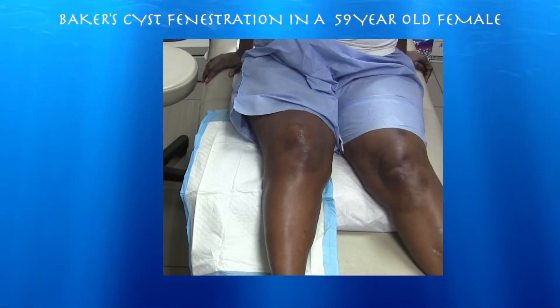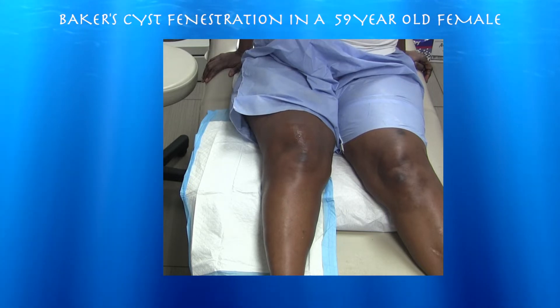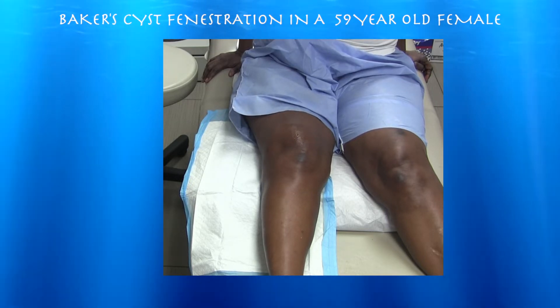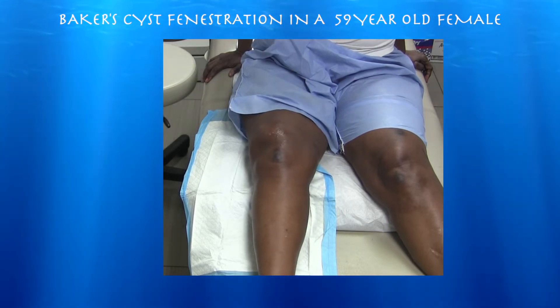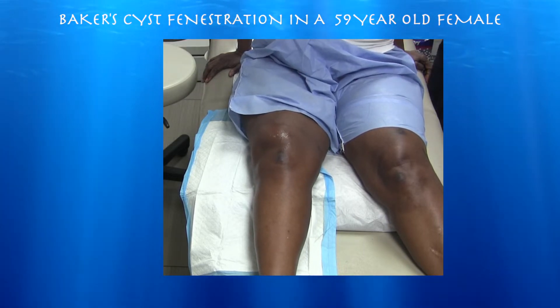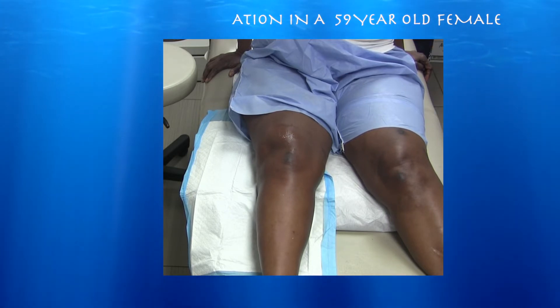She's a 59-year-old female with significant patellofemoral osteoarthritis. She has an effusion and a pretty large Baker cyst, and really the Baker cyst is what's bothering her. So we're going to try to drain the cyst, penetrate the cyst wall to prevent it from coming back, and then inject with some cortisone as well.